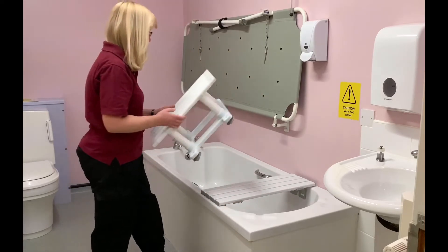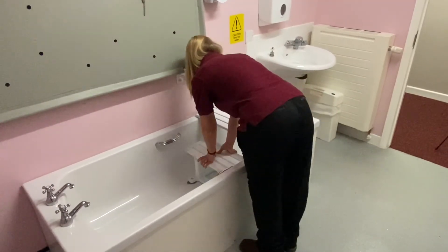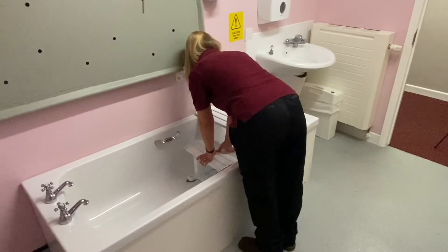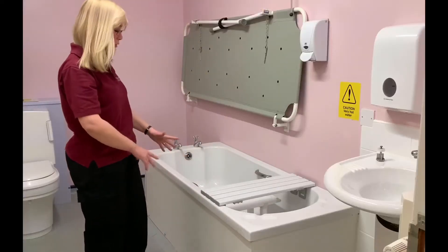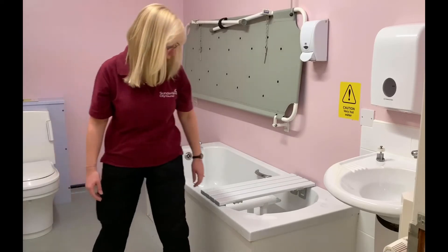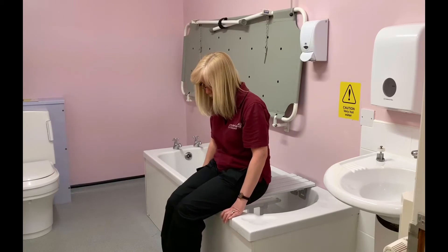The bath seat is then fitted to the bath, pushing down to secure the suction. Once both pieces of equipment are in place, the customer would then lower themselves down onto the bath board.